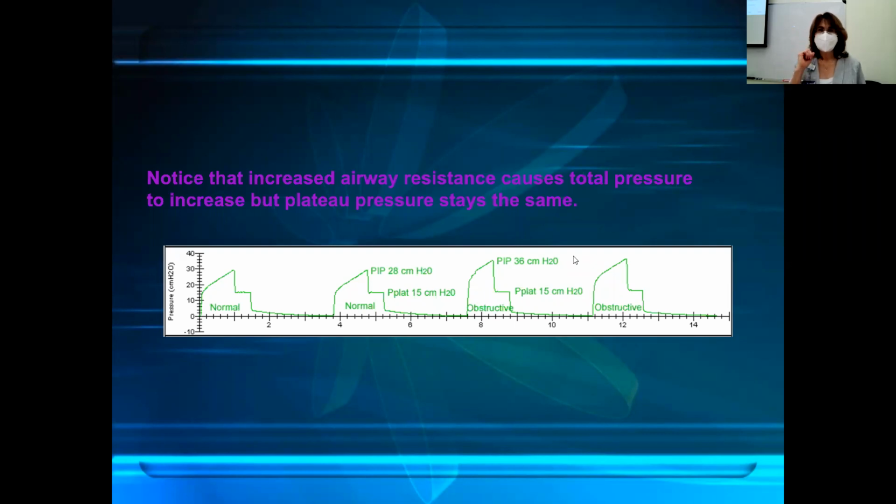If the patient bites down on the endotube, when the endotube is in the patient's mouth and we keep it to the side, probably for comfort, it can easily get between their teeth. And if they bite down, they narrow the endotracheal tube, so the pressure will be a lot higher. When they bite down, they narrow the airway. So secretions, bronchospasm, biting down on the endotube will all cause the peak pressure to go higher.